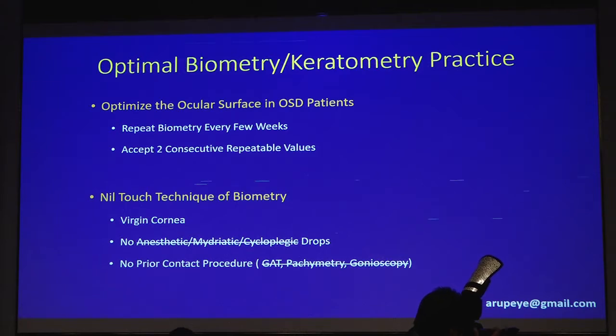I also believe in the no-touch technique of biometry, where you do all the workup on a virgin cornea. Sometimes when you have done a cataract workup, Goldmann applanation tonometry, pachymetry, gonioscopy after insulting the cornea with anesthetic drops, mydriatic agents, cycloplegic drops, the cornea is no longer pristine. So it is important that you don't do the investigations on the same day. Call the patient back on a mutually convenient day and do it.